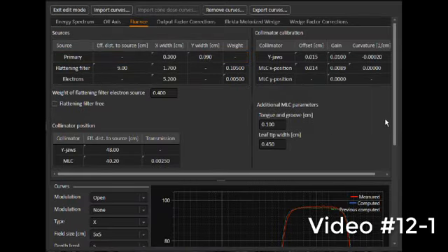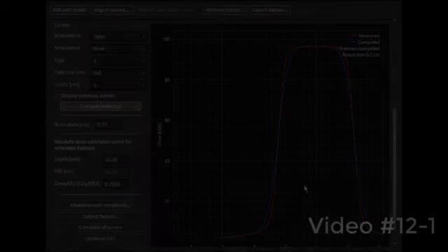So it's important to have a handle on all these. The first recommendation in MPPG 5A is acquiring good, high-quality data for commissioning.